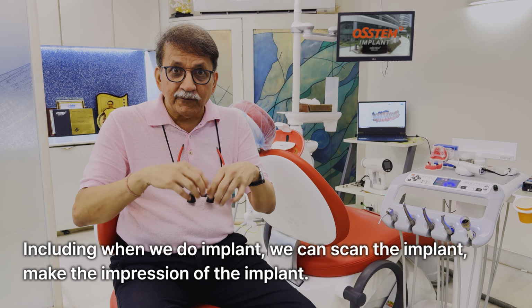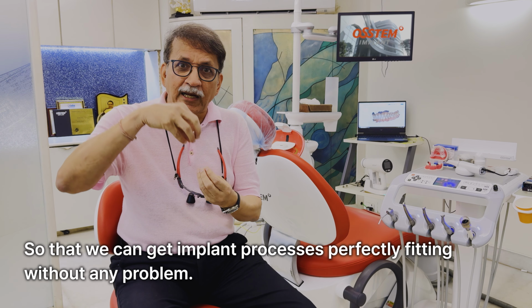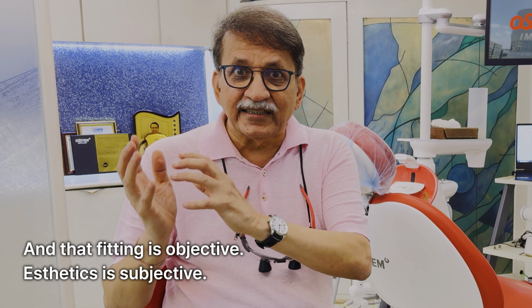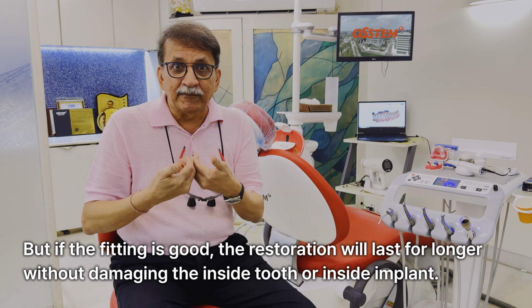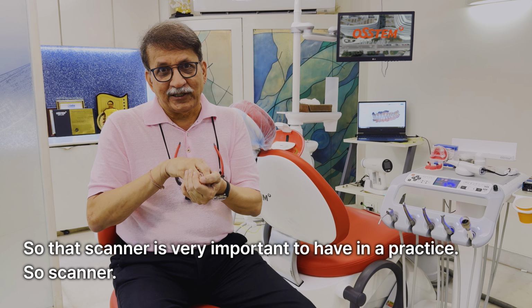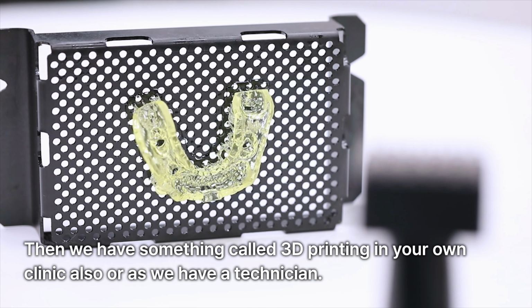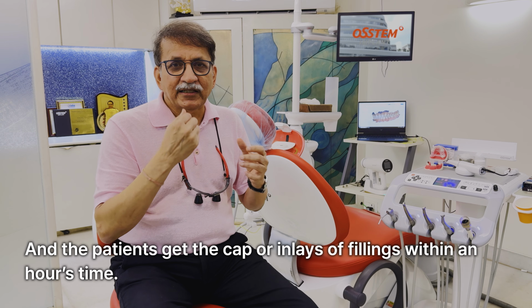If you do implants, we can scan the implant, make the impression of the implant, so that we can get the implant prosthesis perfectly fitting without any problem. And that fitting is objective. Aesthetics is subjective. If the fitting is good, the restoration will last longer without damaging the inside tooth or inside implant. So that scanner is very, very important to have in the practice. Then we have something called 3D printing in your own clinic also, or as we have in the technician. So we can scan here, print, and the patients get a cap or inlays or fillings within an hour's time.